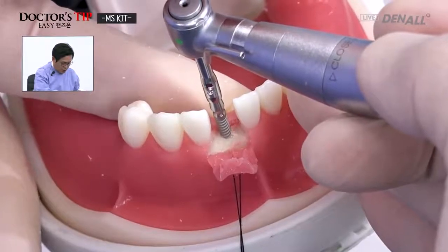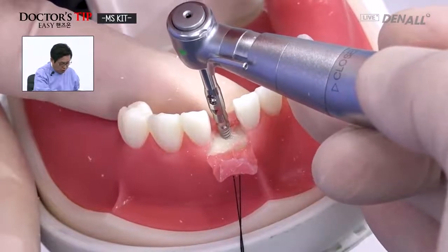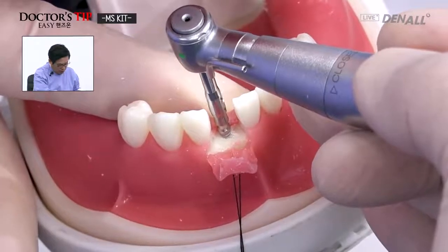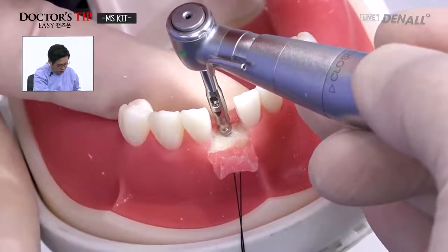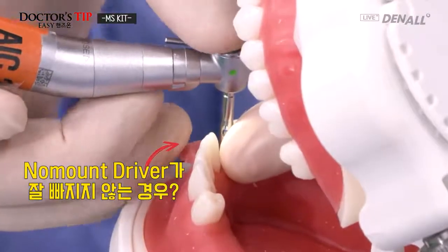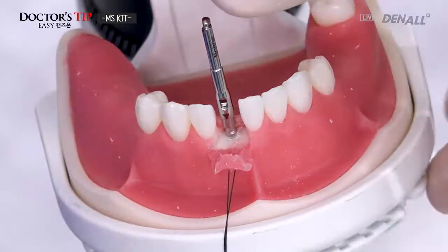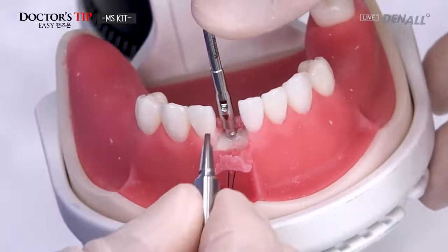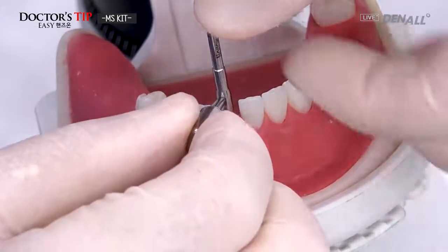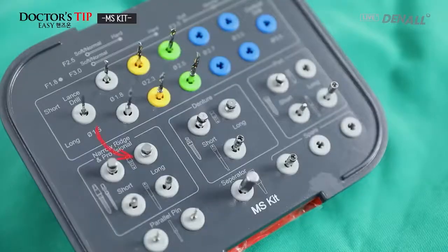If the bone is too hard and placement cannot be done fully, then sometimes you stop and use the 2.3 level higher drill. You can use that even if it's not full length. And if you cannot take it out easily like this, in such a case, if there's jamming, then like this, using the separator, you put it in the side and increase lever action, then it can easily be disconnected or separated.